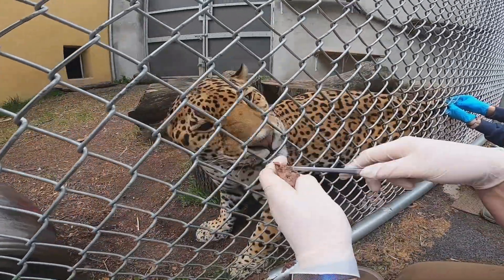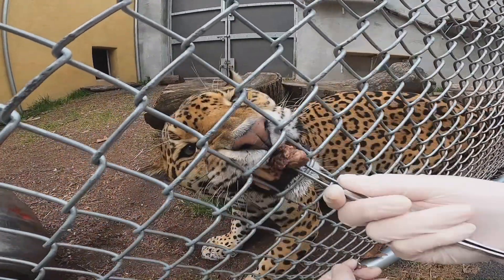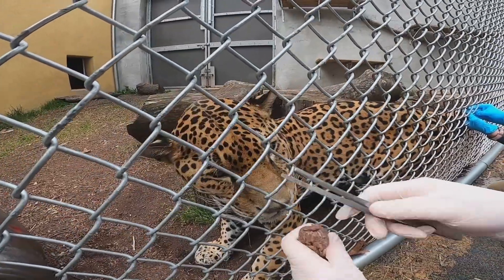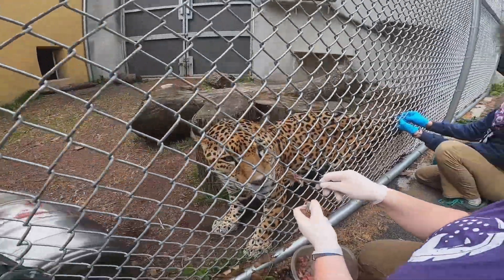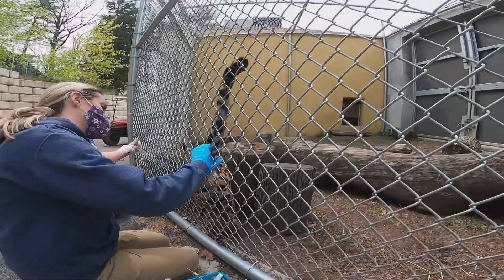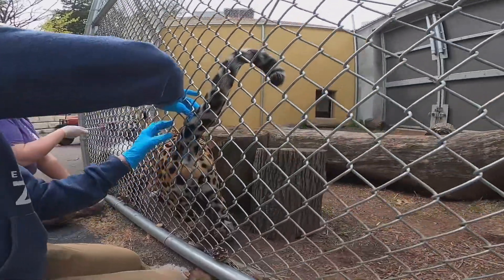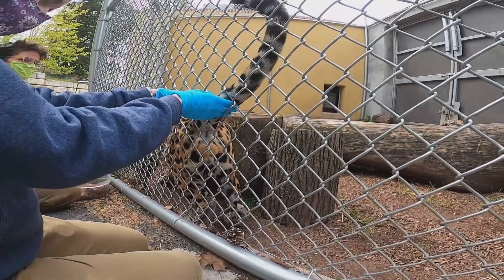As Courtney mentioned, we rely on voluntary training to help facilitate many veterinary procedures, including blood collection. You can now see keeper Mel asking Zian to press his hip up against the fence in his holding yard, which allows Courtney to position his tail in a way that we can obtain blood from it.